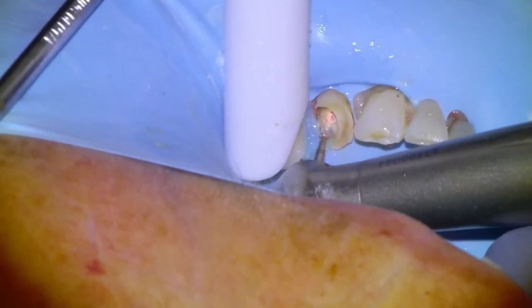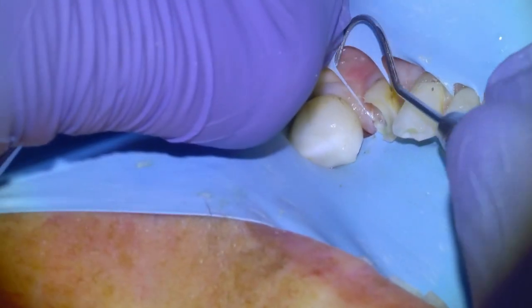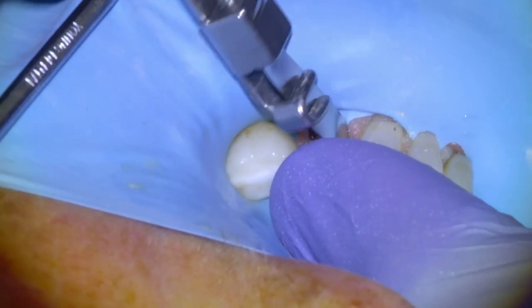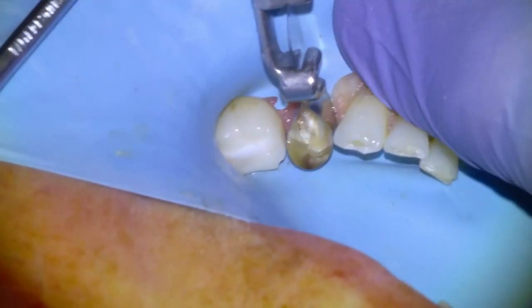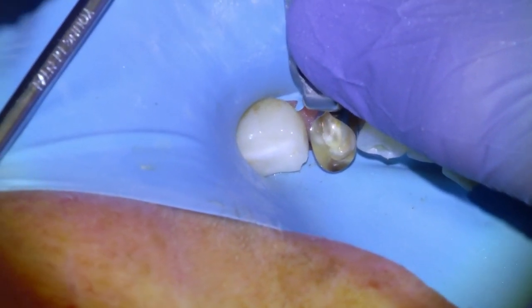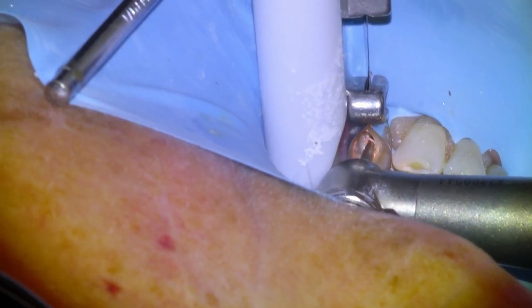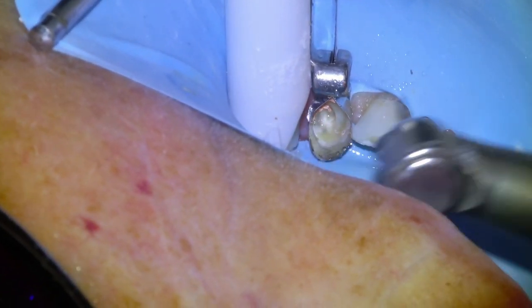We'll do some last minute refinements before we place our core build-up. I had some comments on a previous video saying I should prep down into the orifice or the canal a little bit more for retention of the core, so I did that in this case. I'm going to use a Toffelmeyer matrix on the tooth for the core build-up. I'm a huge fan of Equia Forte, so I actually use that as a core build-up material as well because I've had good success with it. We'll take down the GP a couple of millimeters into the canal for retention of our core.